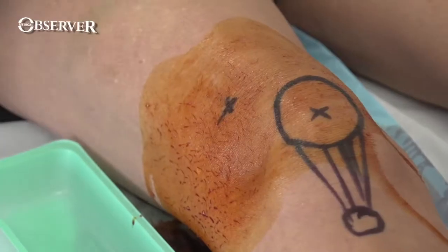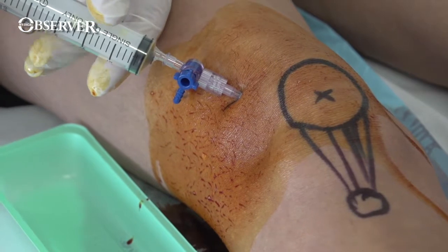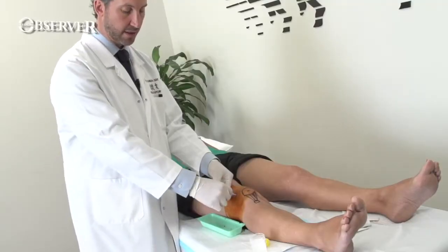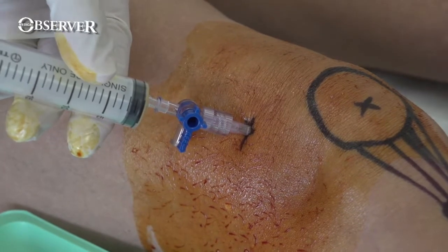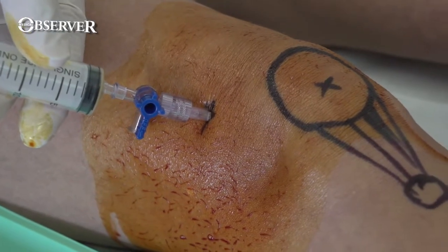Insert your needle and aspirate — you should see fluid travel easily back into the syringe. You can then change the angle of the stopcock to pour the fluid down into your catch, and then return and aspirate again. If you don't have a stopcock, leave your needle in place, detach your syringe, empty it, and then reattach.